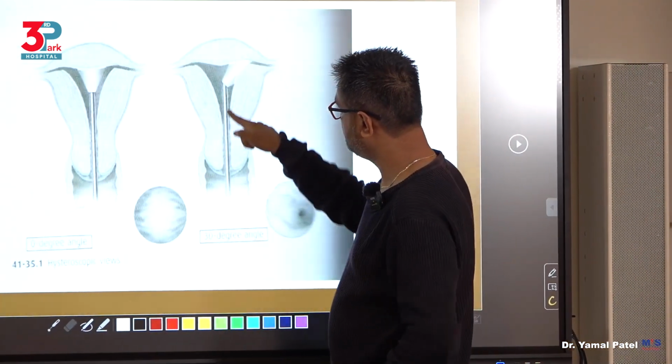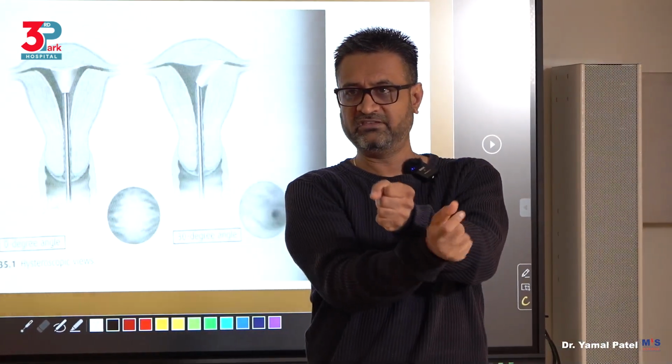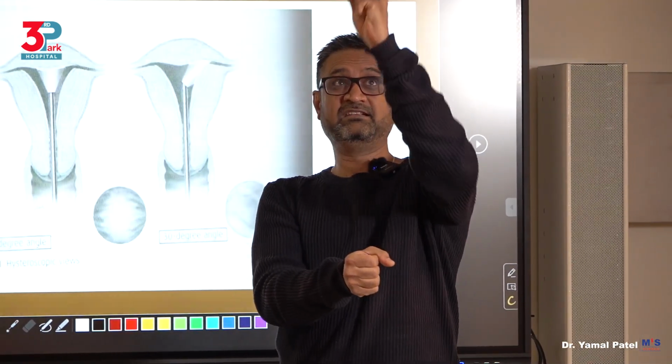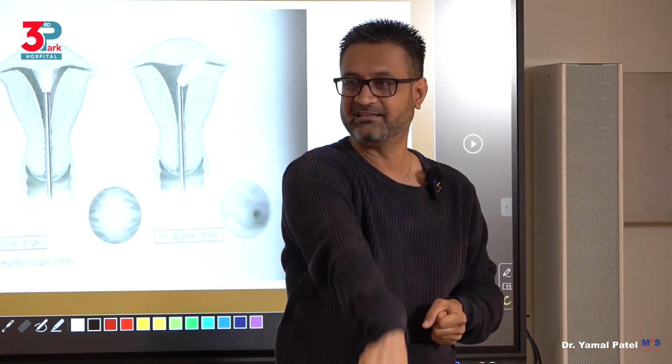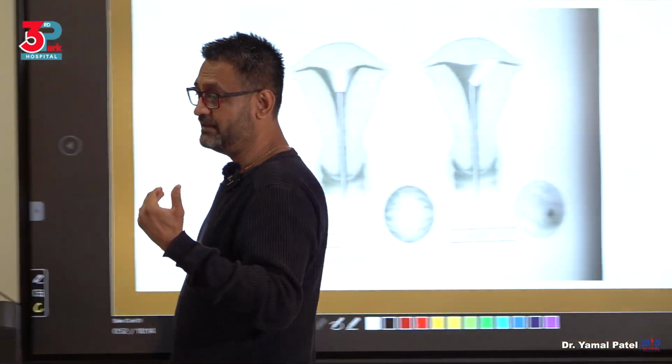Whereas if this is 30 degree, you see it's showing you at an angle just directly. So when my cable goes this way, I'm seeing that way. When my cable goes opposite, I'm seeing this way. When my cable goes down, I'm seeing the top wall. And when I now move the cable completely up, I'm seeing down. So you can see all the 4 walls very clearly by only moving the cable as opposed to moving the whole scope around. Got it? So that's why a 30 degree scope is very good for looking all around in diagnostics.